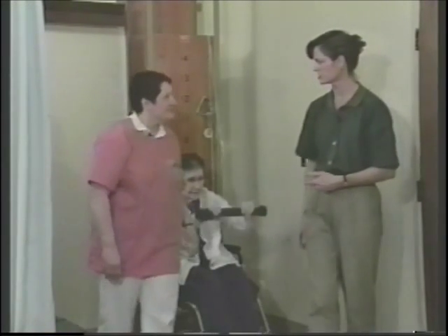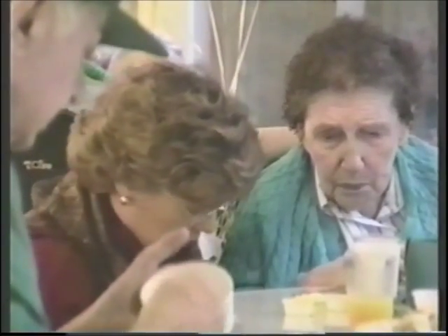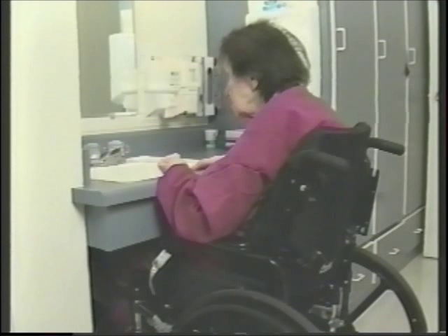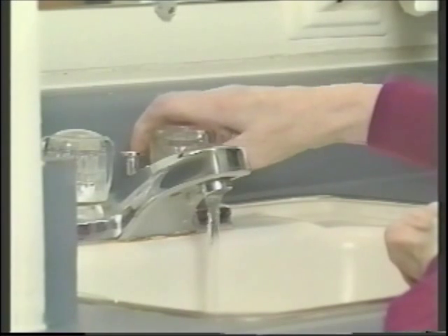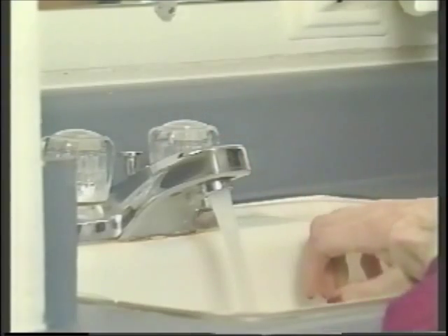Now, Paulette, is this one of the changes that you've noticed since she's had this new wheelchair? Yes, it is. Since we have this new seating arrangement, we have been noticing that Birdie can sit and do more exercises for a longer amount of time. And she seems more comfortable, and she is really doing much better than what she had in the previous seating arrangement, the previous wheelchair.